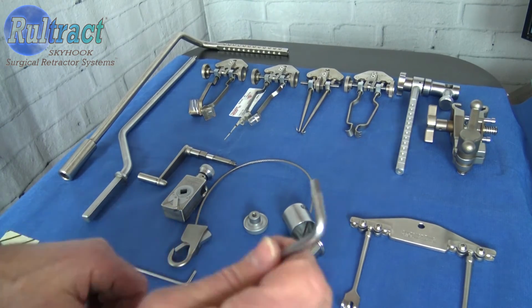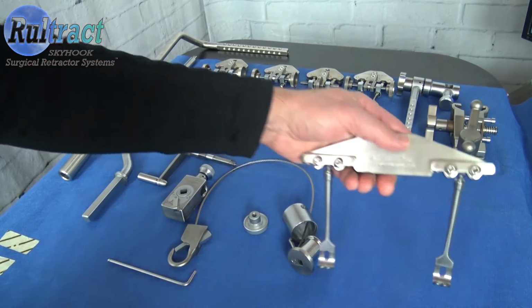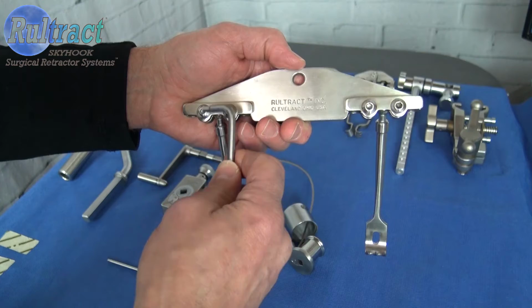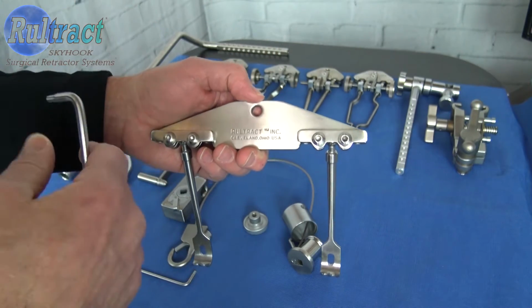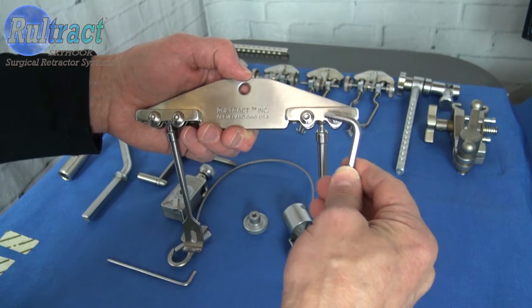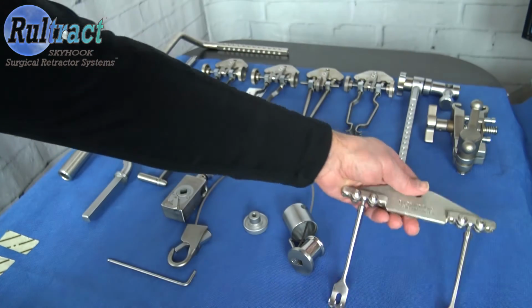Now you're going to take your large Allen wrench and check your rake clamp screws. Now there are 4 rake clamp screws in the rake plates, and there are 4 rake clamp screws in each one of the resternotomy retractors. So use your large Allen wrench to make sure those are tight.